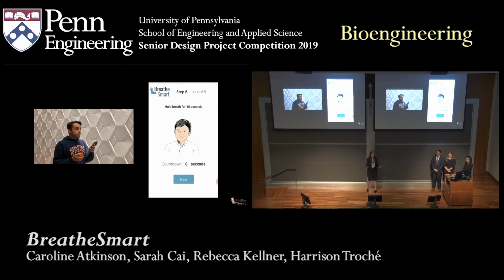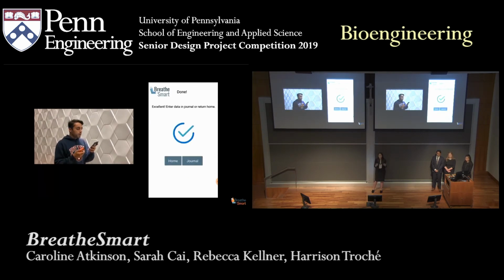Next, the timer goes off. This is to ensure that Harry holds his breath for the proper amount of time to ensure that the medicine goes completely down into his lungs. Good job, Harry has successfully taken his inhaler.